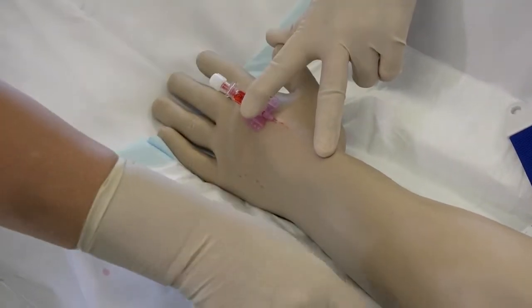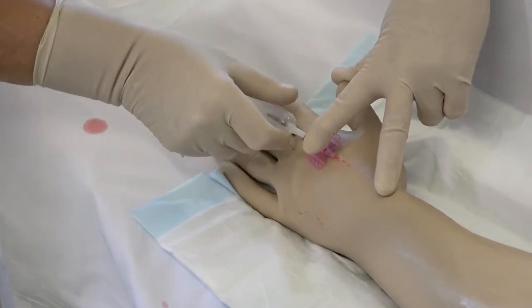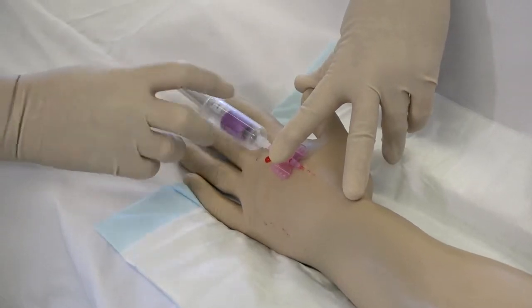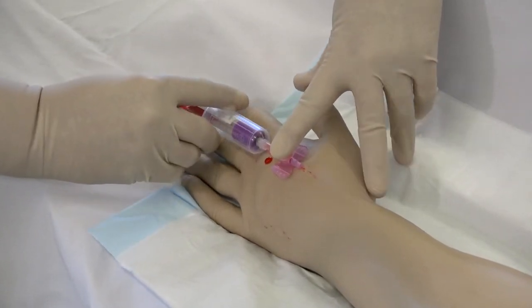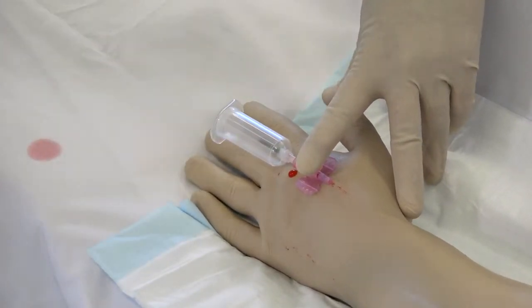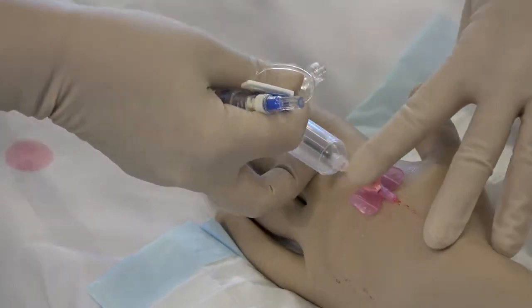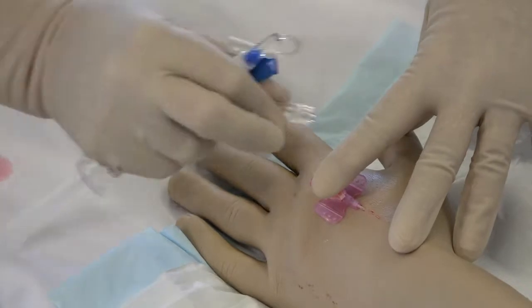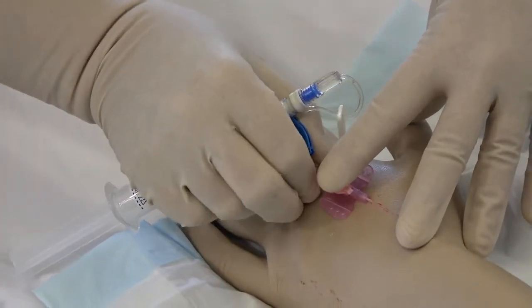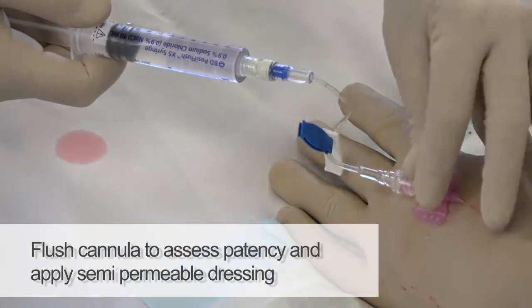Occlude the vein, avoiding the insertion site, and attach the vacutainer. Attach the blood tubes as per order of draw until the required sample is collected. Remove the vacutainer and connect the J-loop. Flush the cannula to assess patency.